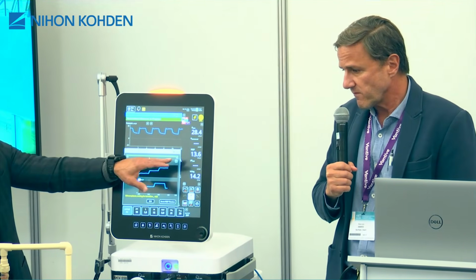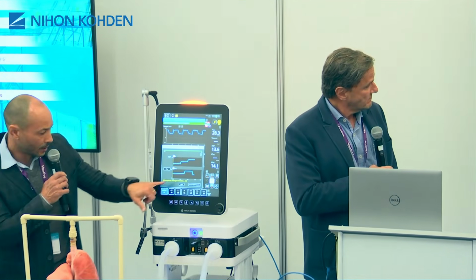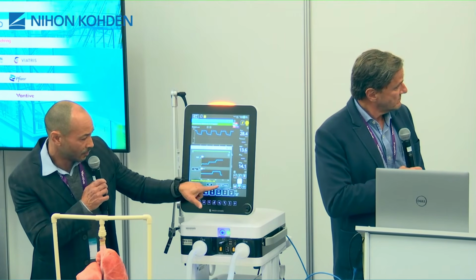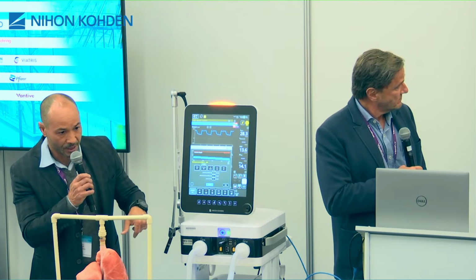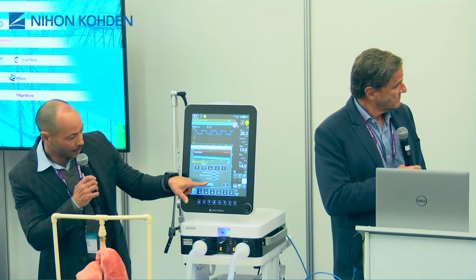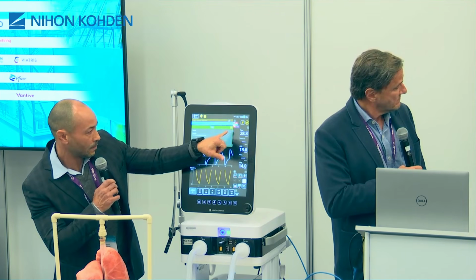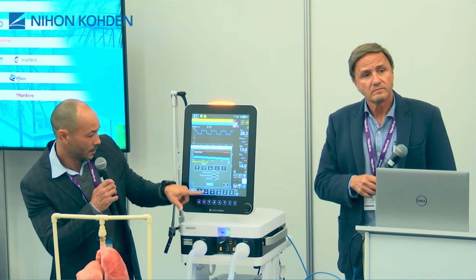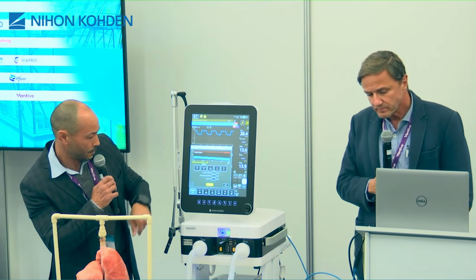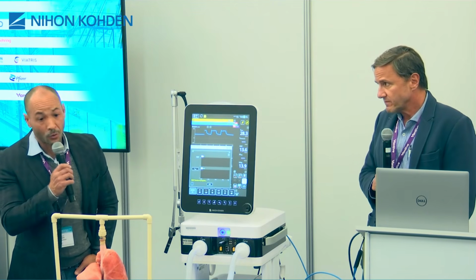So now the ventilator finished the maneuver. We are at the PEEP of 13. And the ventilator is asking you, do you want to go to PEEP titration? Yes or no? If no, you can come in here and do end. Or if yes, you can come in here and do the PEEP titration. Automatically, the settings are here. Let me do a short one. And then we start the PEEP titration here, a decremental PEEP titration.